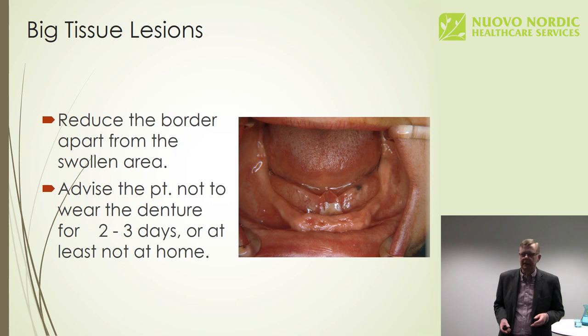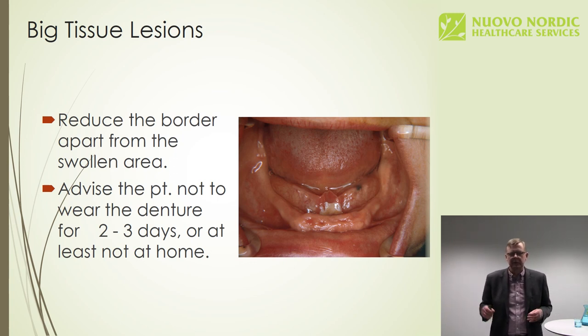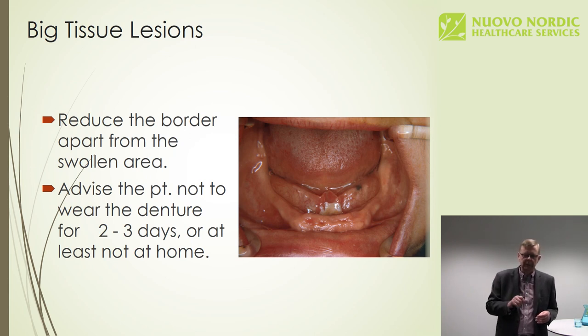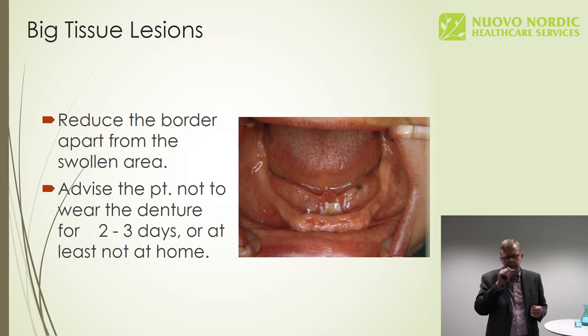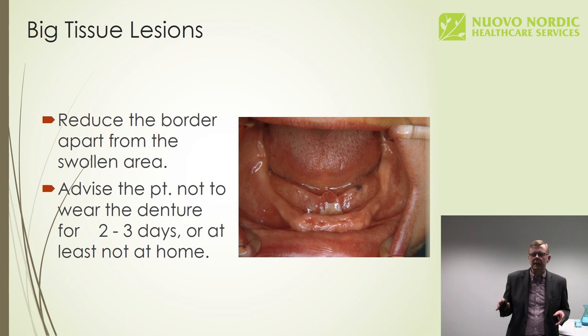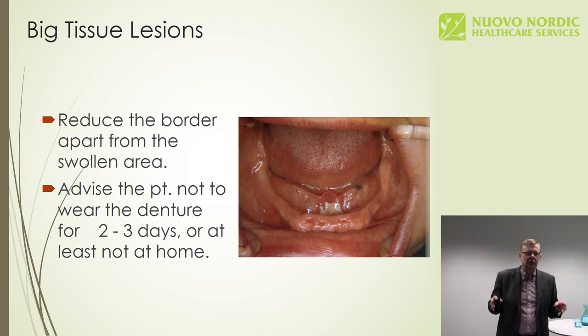Then there are also much deeper pressure spots where you really should reduce the border a bit more and advise the patient not to wear the denture for at least a couple of days. Now you have to remember that you shouldn't grind the denture too much. It's so much easier to grind off from the border than to add some material to it if you have ground too much. Which means that you have to explain to the patient that I'll only grind a little bit of this border or these pressure spots, and once you have not worn the denture for a couple of days, the tissues will subside, the swelling will be gone, or at least it will be much less, and then the denture will most likely be painless, or at least it will cause less pain.